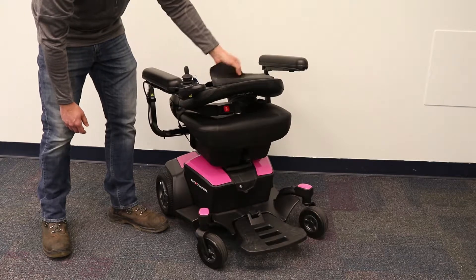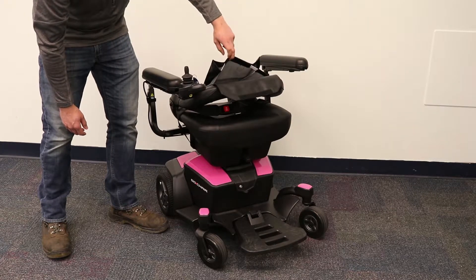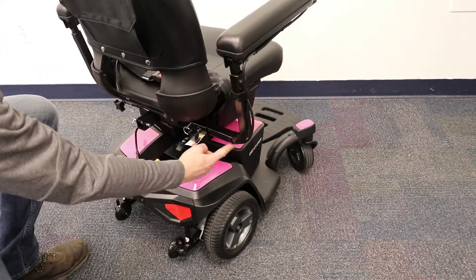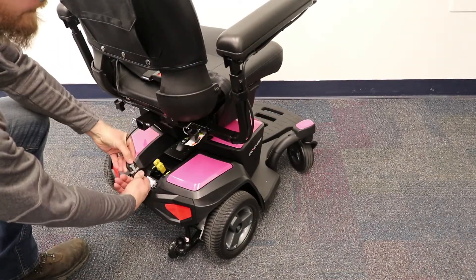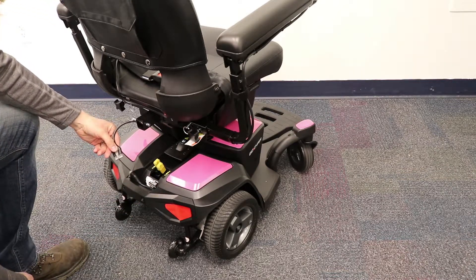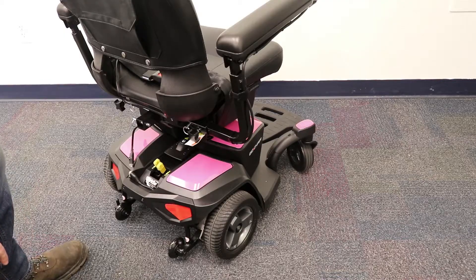With that out of the way, let's go over how to break this power chair down. The first thing you will need to do is follow the cable from the joystick to the base of the chair and disconnect it. This will allow you to take the seat off of the power chair.